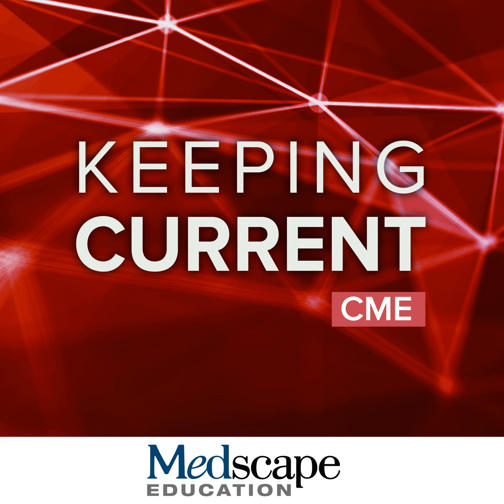I really wanted to start with this case as this patient presented. This was a patient who came into our emergency department, and it was suspected they had an aortic dissection. So really this patient's journey started at our hospital with a CT to rule out dissection. What was picked up, even in the emergency department, was low attenuation of the left ventricular myocardium. You can see that at the apex. This is non-specific, of course. There are a number of reasons for this, but one potential cause of hypoperfusion is myocardial ischemia in the setting of an acute infarct, and that obviously would fit with acute chest pain.